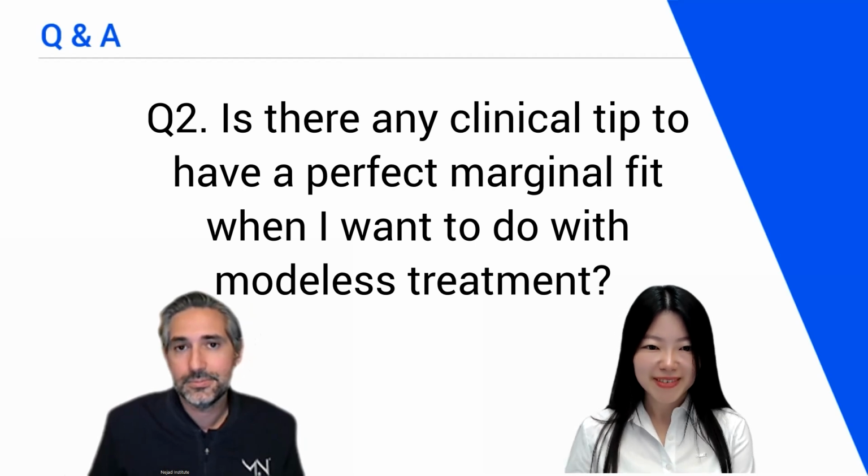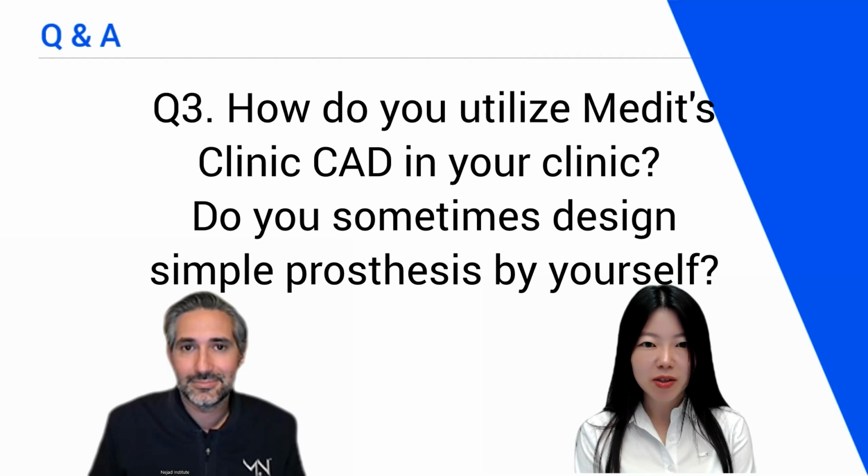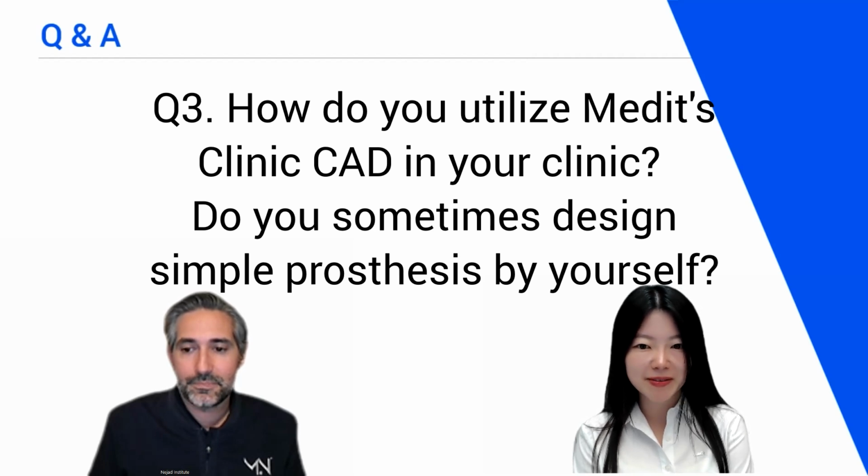Okay, thank you for answering that. Of course. We are left with the last question. Okay, question number 3. How do you utilize Medit's Clinic CAD in your clinic? Do you sometimes design simple prostheses by yourself?